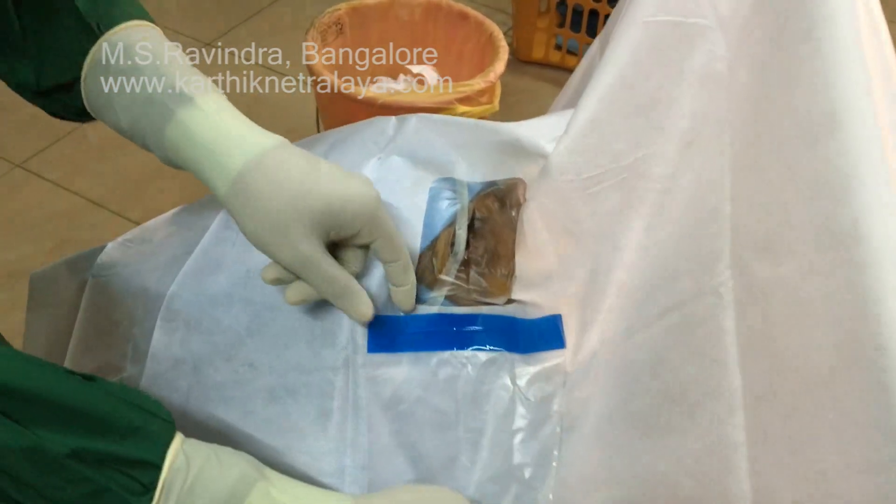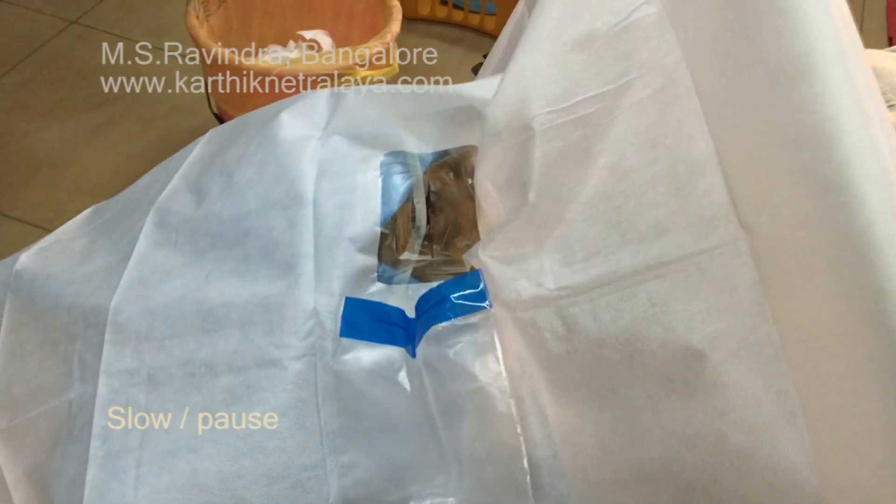A nice drape is now in place, well stuck, and the fluid bag is opened up.